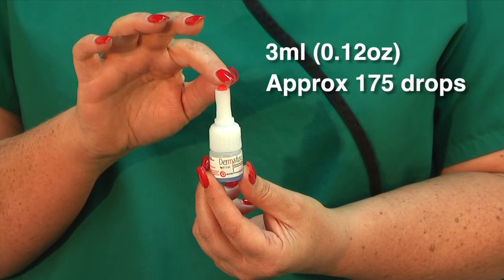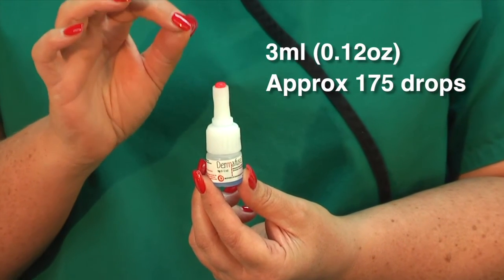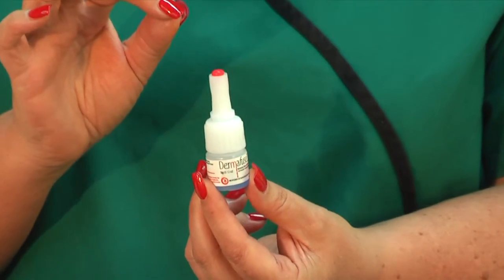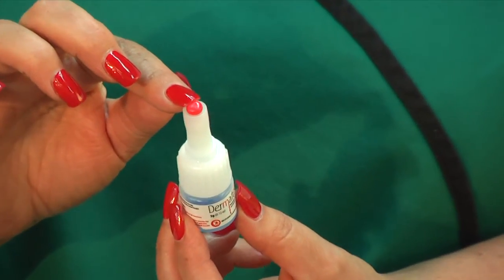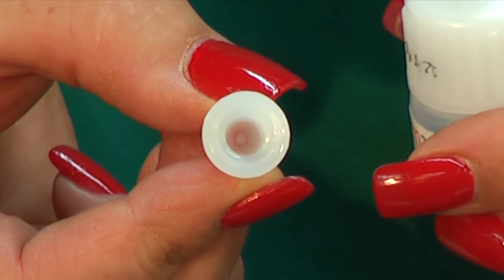Each 3ml bottle is equivalent to 0.12 ounces containing approximately 175 drops. Dermafuse has a unique built-in spike within the cap; this prevents the bottle becoming occluded with glue once opened.